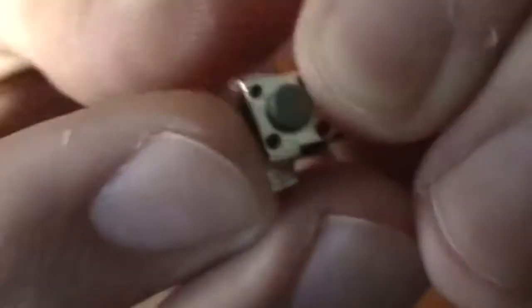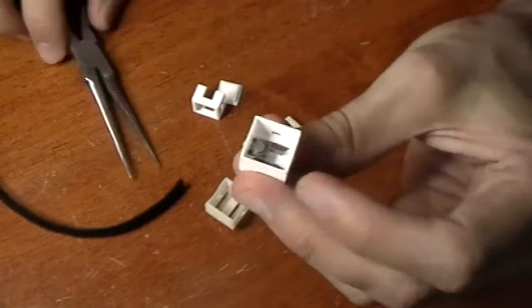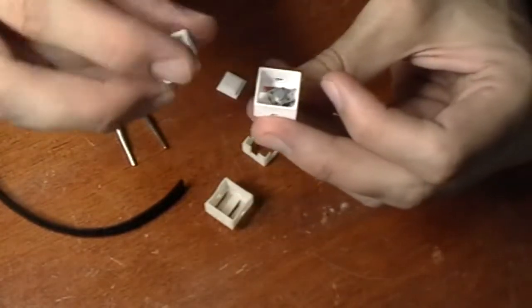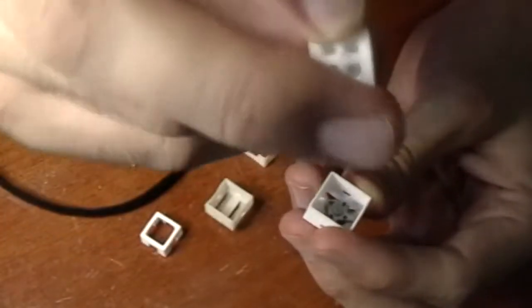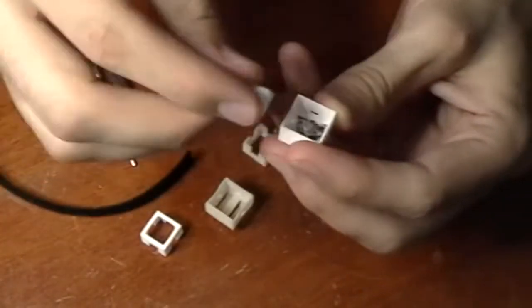It's three parts so you can fit these small little tactile switches in there. This is the hard plastic version. After you solder the wires, the wires fit out through one of these holes in the sides. I have this collar piece and the actual button piece.